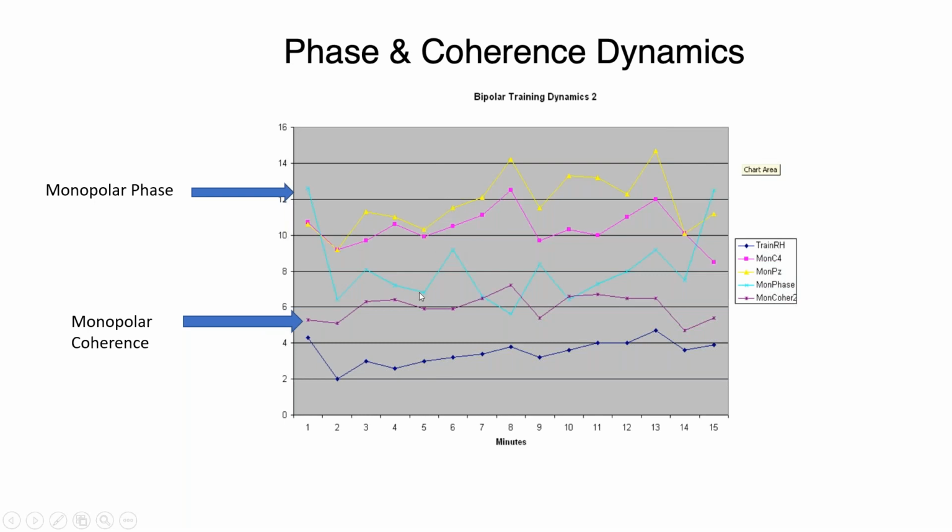So we do have some disagreement, and you would expect that if here is the amplitude going down, but the bipolar is going up. And since coherence is staying the same, something has to give. So what gives is phase. It reverses direction. And we see that again here. Both coherence and bipolar training are going up, and so something has to give. And what gives is phase. Even I get mixed up here. But basically what you can see is that in particular, phase is the place that changes if coherence and amplitude are all going up.